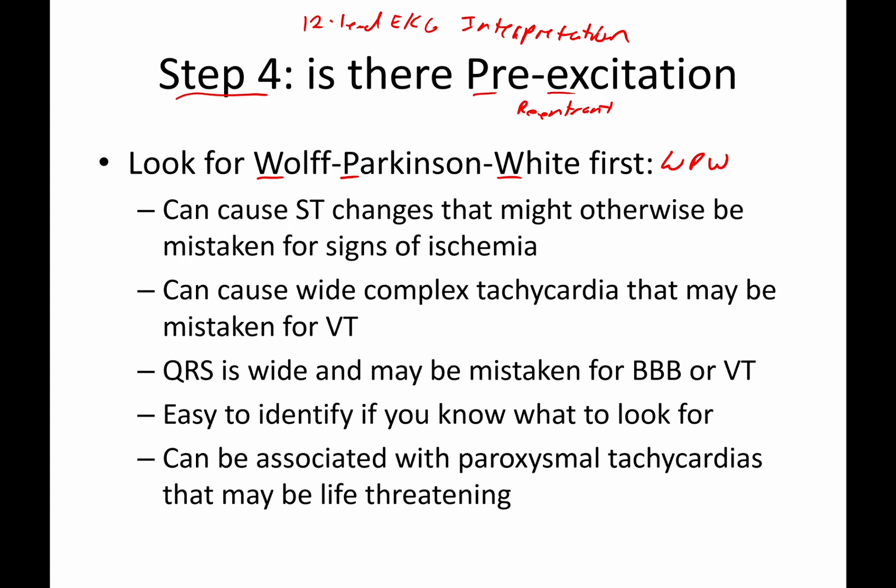Why are we talking about it now? It's a 12 lead class. We're here for heart attacks and all the really cool stuff like that, right? Well, the thing about it is this. If your patient is having a re-entrant rhythm, it's very easy to miss that step. And the bigger risk is that for patients with re-entrant rhythms, it creates a change in the way the EKG lays out.